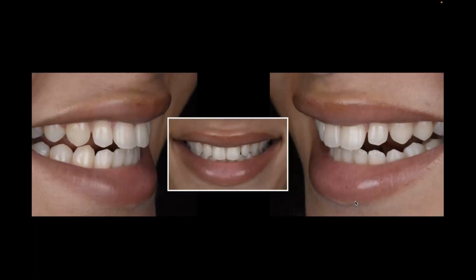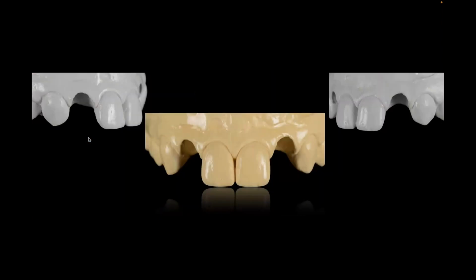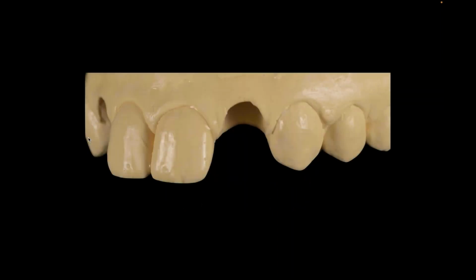So a case like this, the patient has beautiful teeth, a beautiful face, and really just was unhappy with the spacing here. I wish we would have done a little window veneer on the cuspids and then the veneer on the lateral. We didn't prescribe it that way. Looking back, I think there was a mistake. We probably should have added a window veneer to the cuspids, but we did wind up treating this with one veneer. So the space management was really challenging. So we make our alveolar model as we normally would. And then from that alveolar model, I'm making my refractory dies.